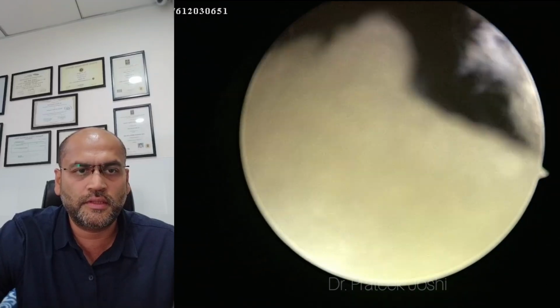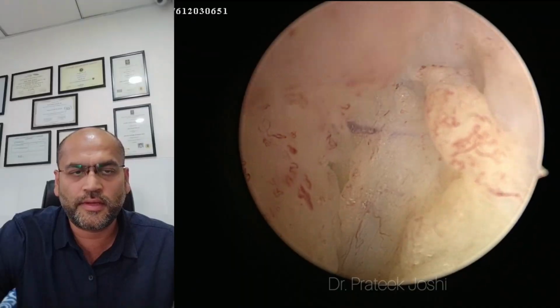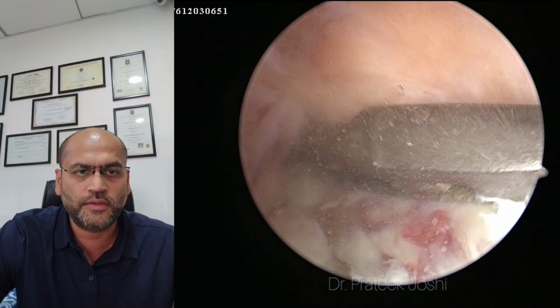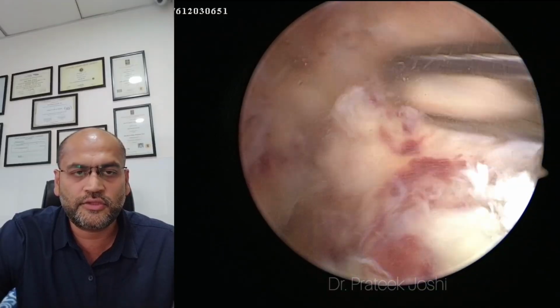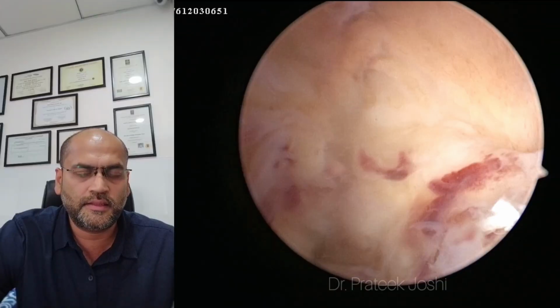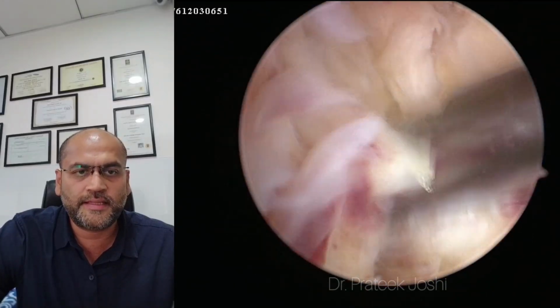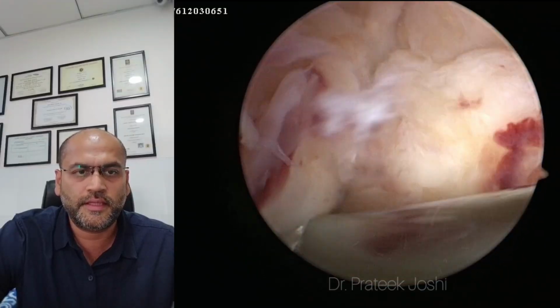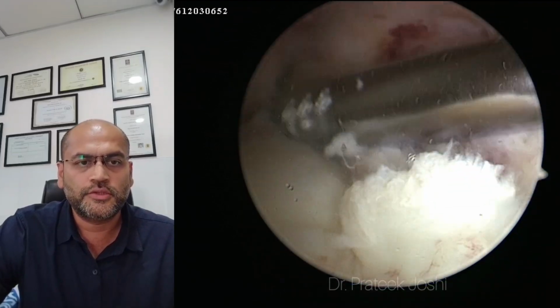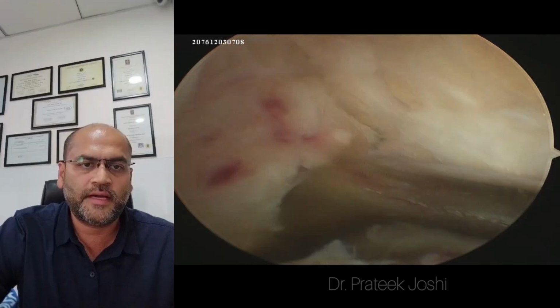We need to remove the fat pad for us to have a better vision all around the intercondylar notch. What you are seeing is I am using an arthroscopic punch to remove remnant ACL tissue from the femoral side. This step is important to identify the femoral ACL footprint. Unless we understand where exactly the femoral ACL footprint is, it will be difficult to do anatomical ACL reconstruction surgery. As you can see, I am using an arthroscopic punch and arthroscopic shaver to identify the femoral footprint.